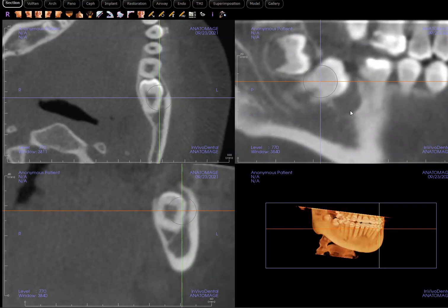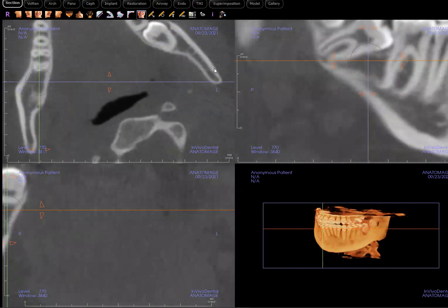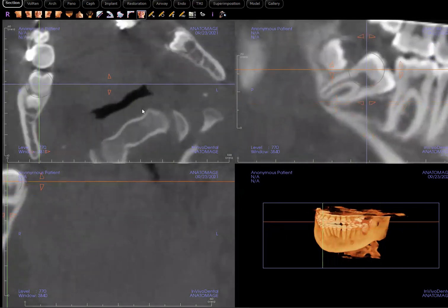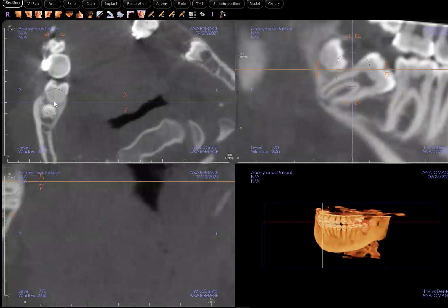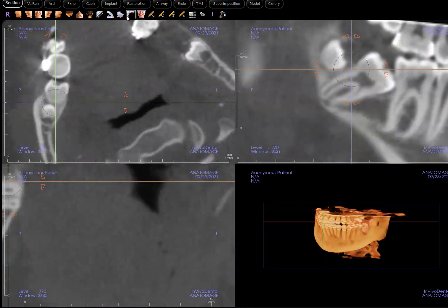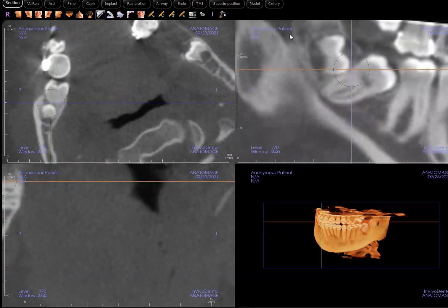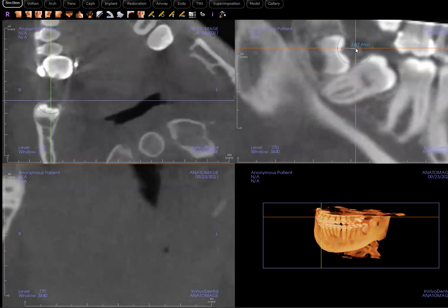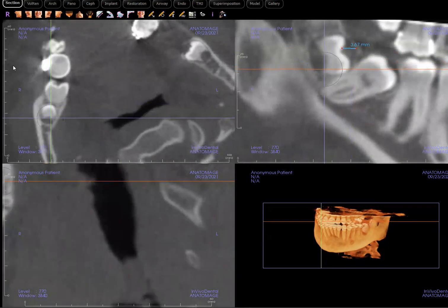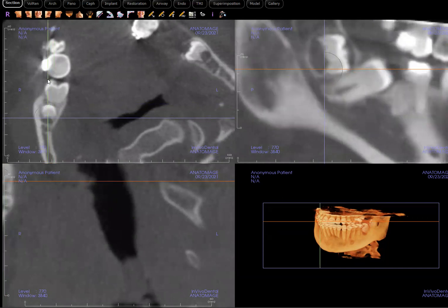We can always learn more about the lesion by comparing to the normal side. So let's look at the other side — the unaffected, healthy side. Right here, that follicular space is probably less than a millimeter. That's what a normal follicular space should look like. And on the affected side, it's about three to four millimeters at most.